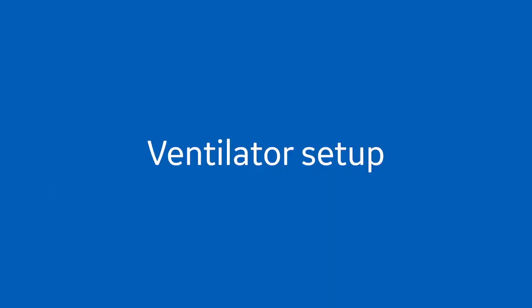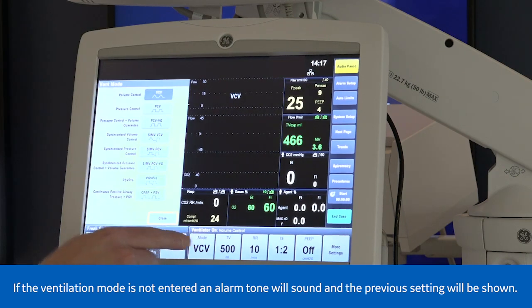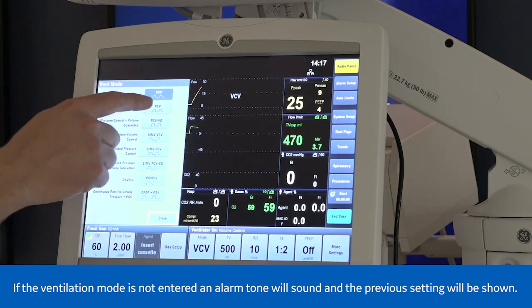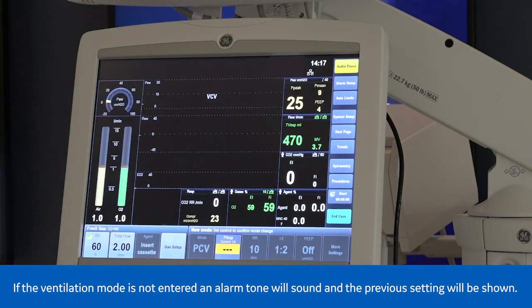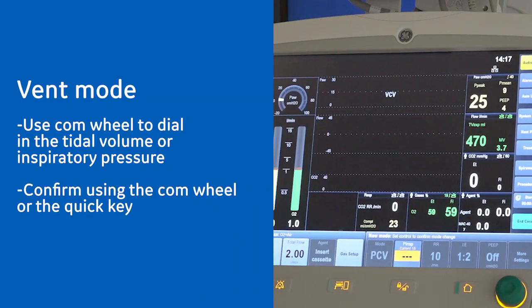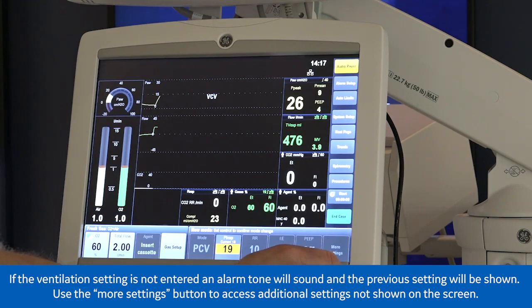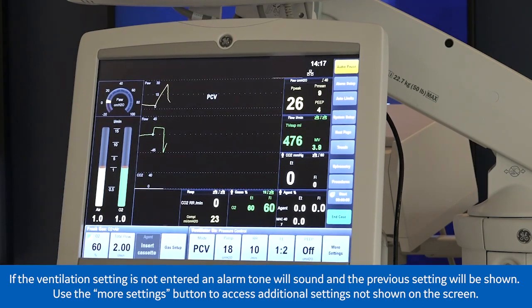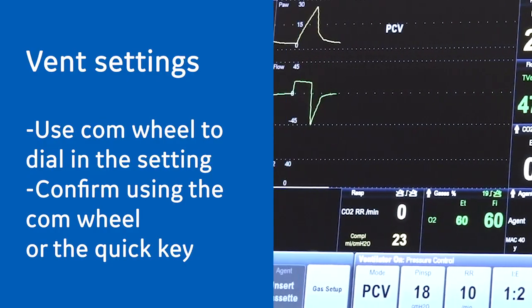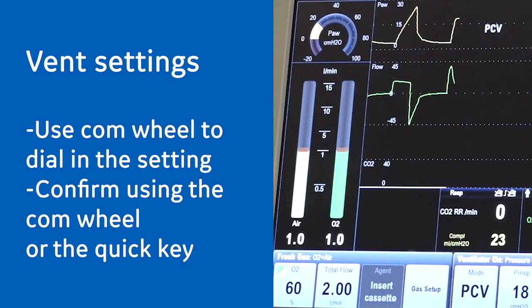To change the vent mode, select mode to choose the appropriate ventilation mode for the patient. Use the com wheel to dial in the tidal volume or inspiratory pressure and confirm by using the com wheel or by pressing the quick key. To change the vent settings, select the ventilator quick key for the desired parameter to change. Use the com wheel to dial in the setting and confirm by using the com wheel or the quick key.